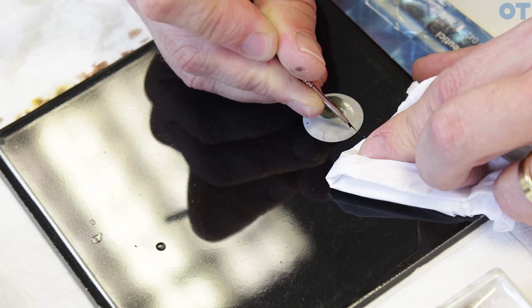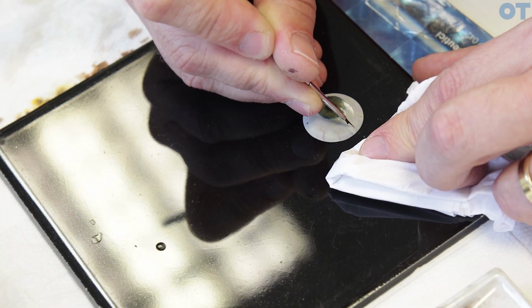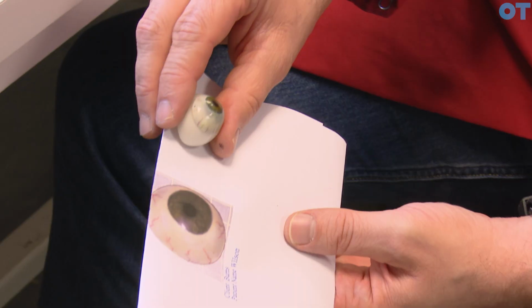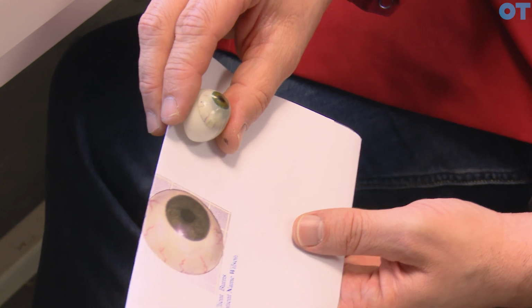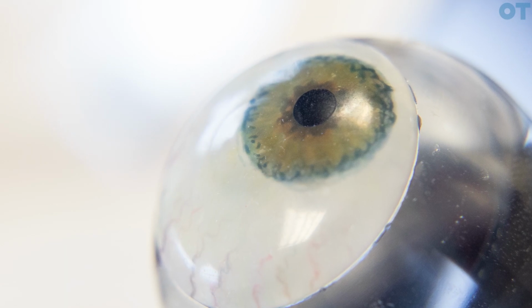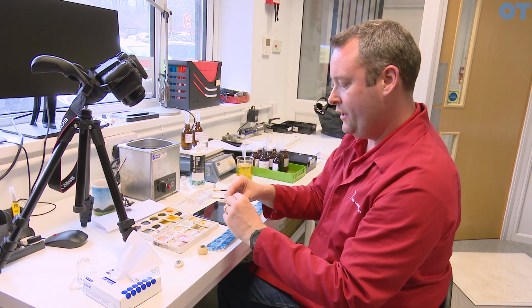Yeah, I just want to emphasise those veins a little bit more, and then I think we'll have something close. It's kind of matching that, and that's going to go into the oven, then the colour will be cured, and I have to see how the colour reacts and develops before I go too far. Then I can adjust it. Yeah, so that's pretty much the process.